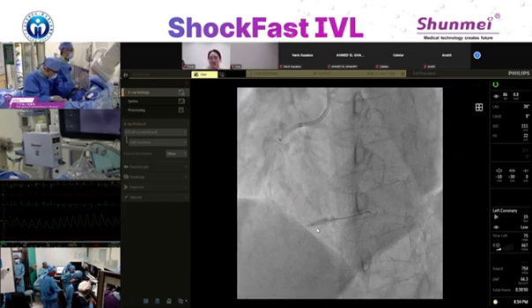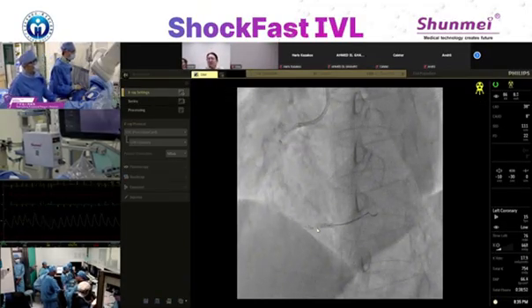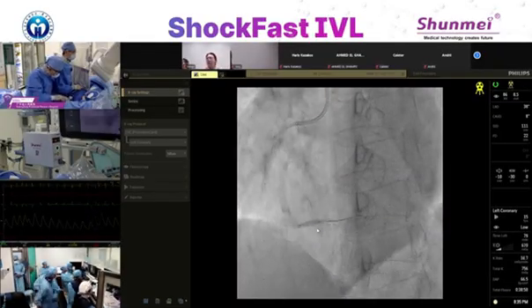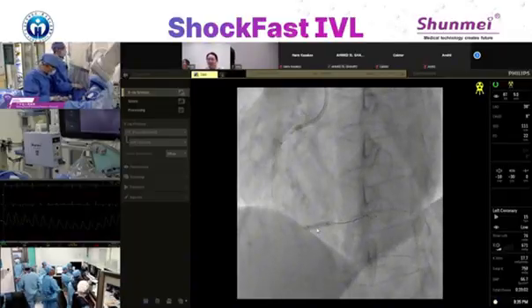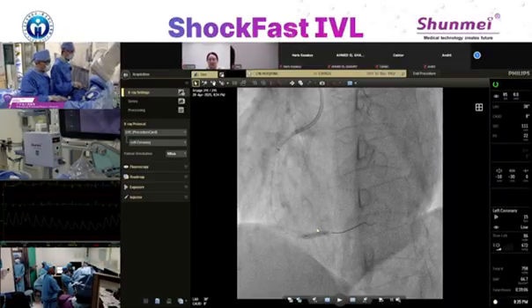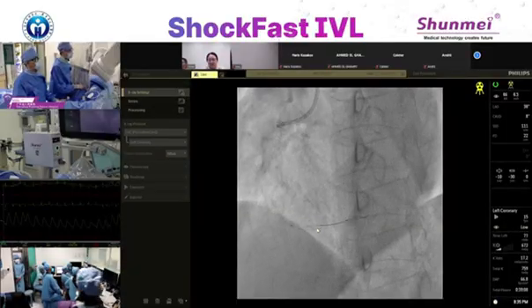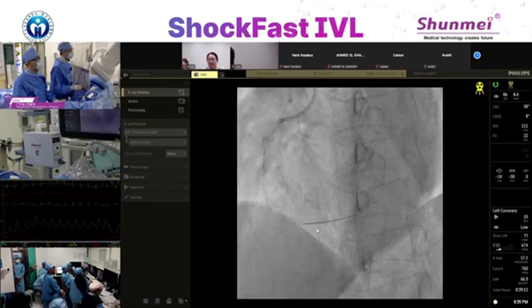Down. And a little bit back. Okay. 26. Now 26 atmosphere.